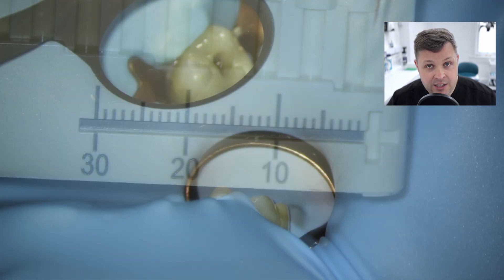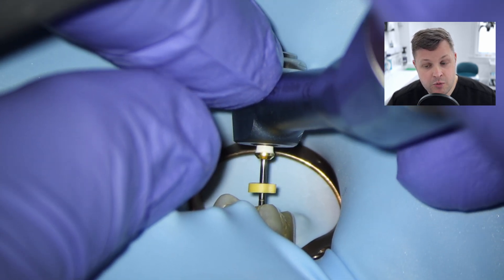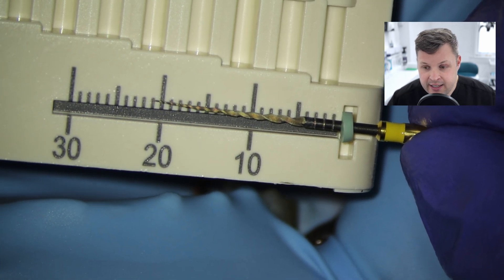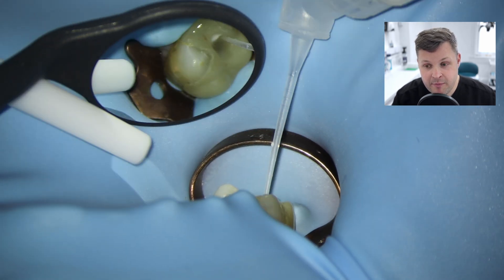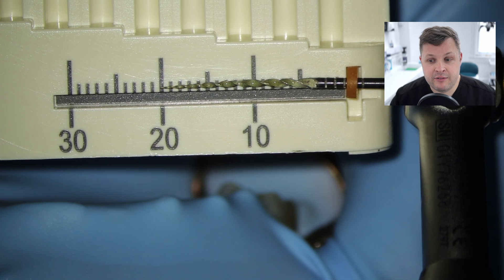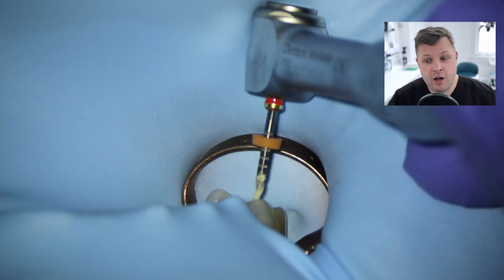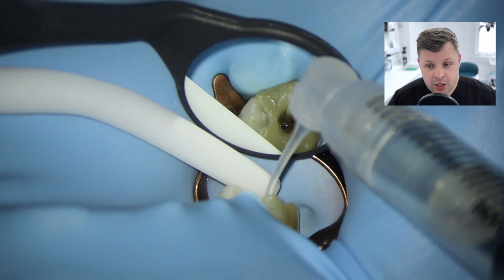We're going to use the glide path file at 21 at zero, using T-mode - which is kind of like a reciprocation, like a watch-winding type, until I get almost to the working length and it turns into rotary. I'm going to use a size 20 high flex. I don't often use a size 20 - I usually go from a 15 to a 25 - but this canal is so closed up that I want to use the 20 so my 25 doesn't get caught up and cause a ledge. We're going to use this at 20.5 millimeters rather than 21, minus 0.5mm from the working length, accounting for the apical constriction, with lots and lots of irrigation.